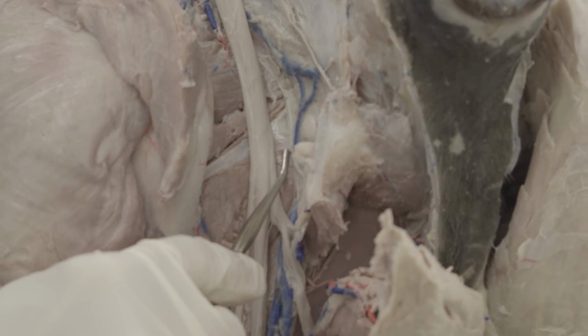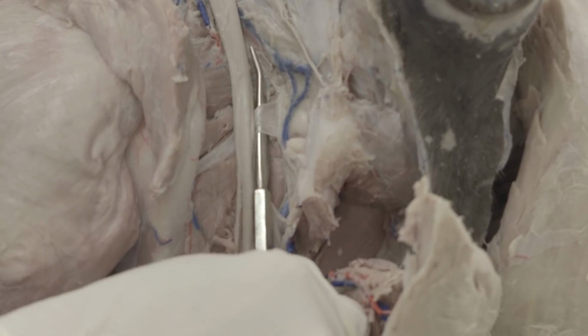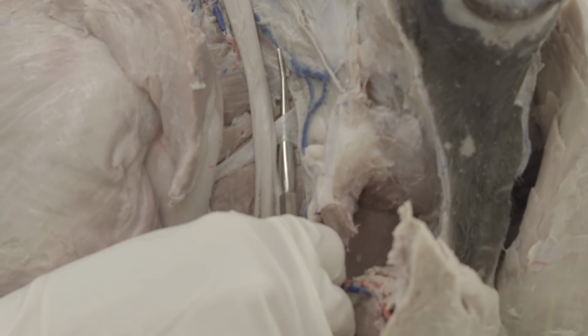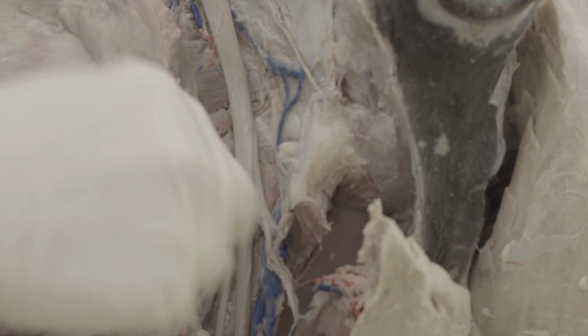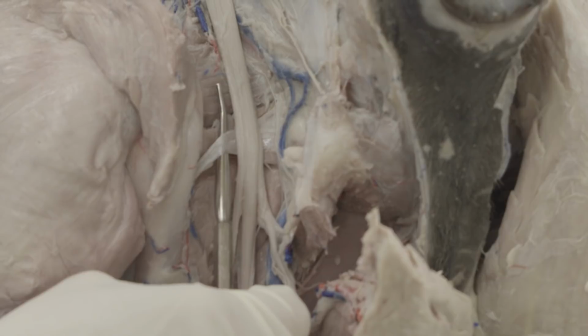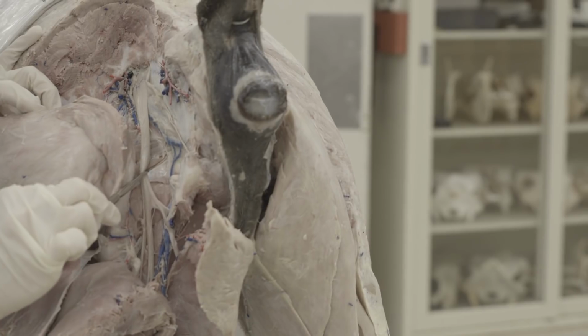And you have this tendon poking through. So I'll try and put the probe underneath it so you can get a better look at it. That is the tendon of the internal obturator muscle. So that little tendon comes through, and you want to be able to see that. And you may have the sciatic nerve that's kind of in the way, but hopefully you can work around it. So that's the internal obturator tendon that you see there.